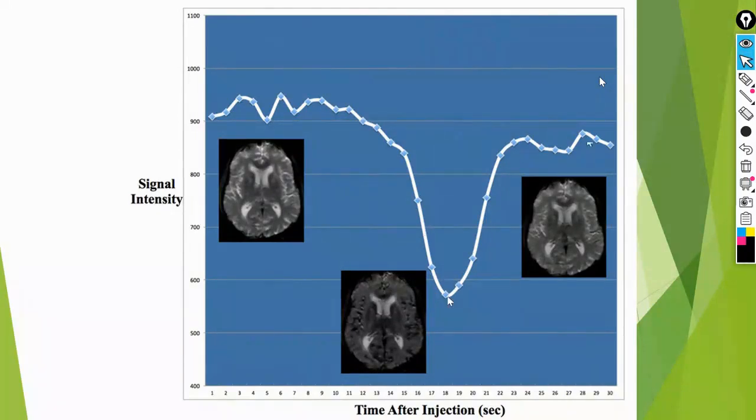No, the contrast agent will exit now after it has been absorbed. This contrast agent exits the body. So when it exits the tissue, does it have to go back out again? Yes, doctor. I am currently taking an image from the tissue. I am getting a signal from it, okay?